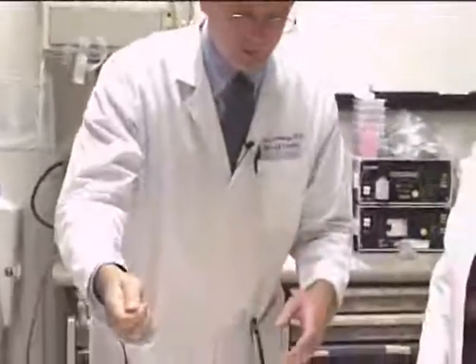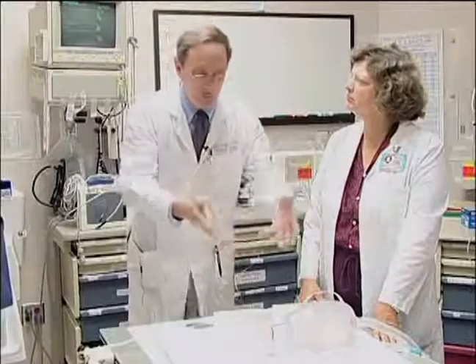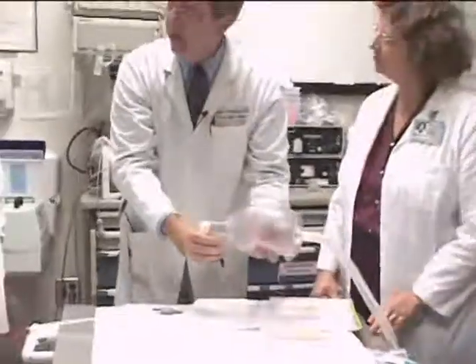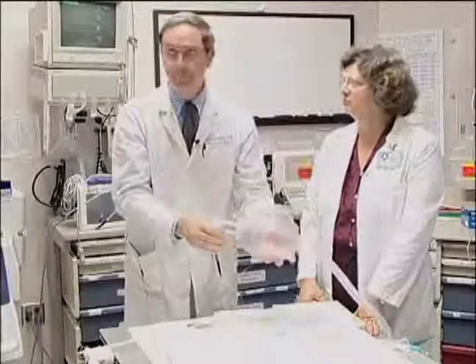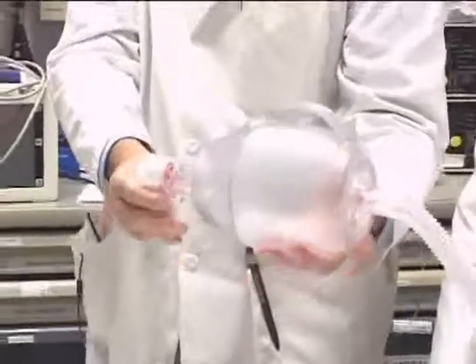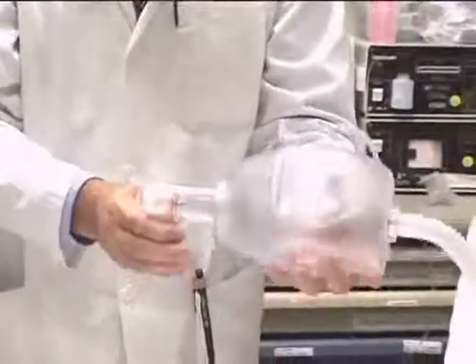So as that Combi tube comes out, we can quickly suction the patient, put in the oral pharyngeal airway tube, and/or put in the nasal trumpet, so that when you come on with the mask, we've got an ability to bag this patient, and quickly we'll know whether we're able to bag them or not. Now, chances are not in our favor about being able to bag them because the medics couldn't do it in the field. So if it's looking like we're not able to get the sats up, we try with the jaw thrust a little bit. Remember, we need to maintain inline stabilization.